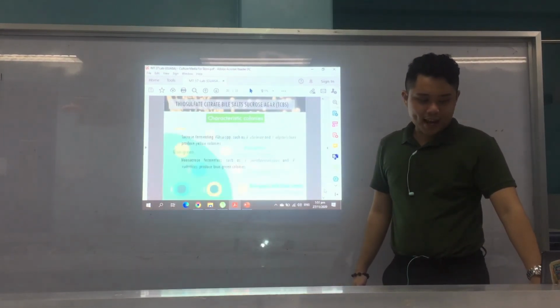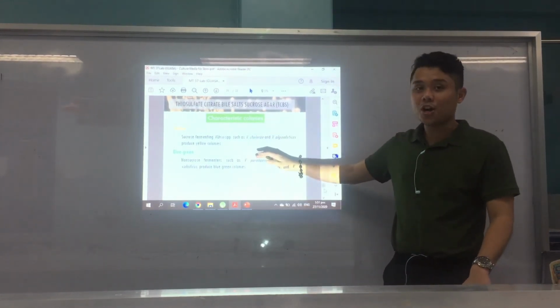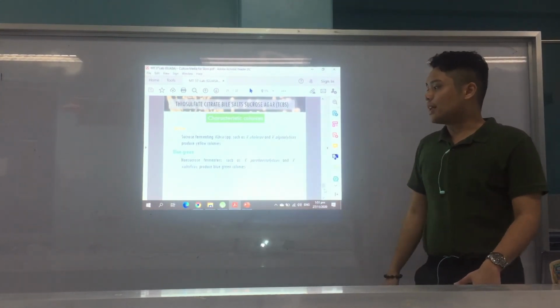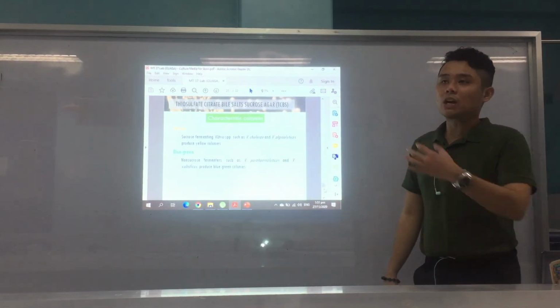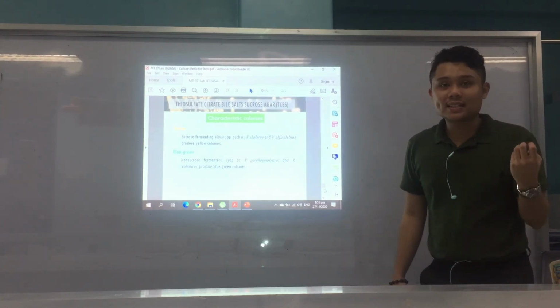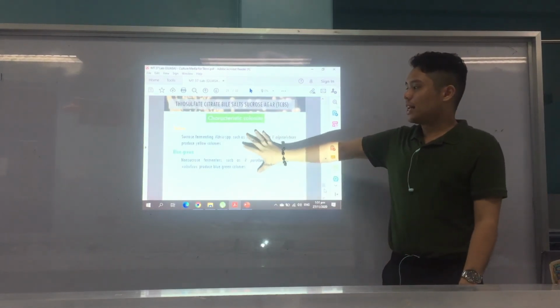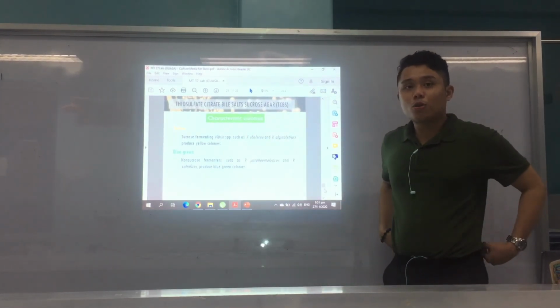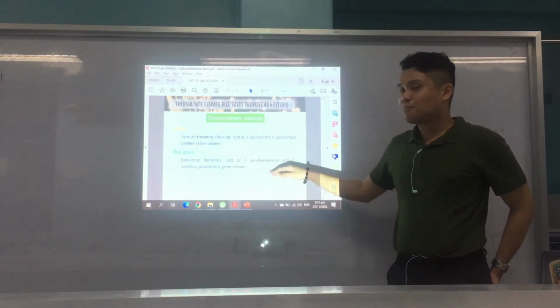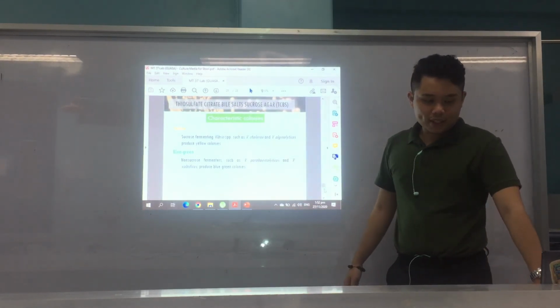Okay? And for characteristic colonies, yellow, sucrose-fermenting Vibrio such as Vibrio cholerae and Vibrio alginolyticus. And blue-green non-sucrose fermenters, Vibrio parahaemolyticus and Vibrio vulnificus. Okay, the rest with black centers could be other enterics that we isolated from the specimen. But what we're looking for is yellow or blue-green. If yellow, could be sucrose fermenters, again Vibrio cholerae and alginolyticus. And if blue-green, you have parahaemolyticus and vulnificus. Okay? Alright, so that's for TCBS.